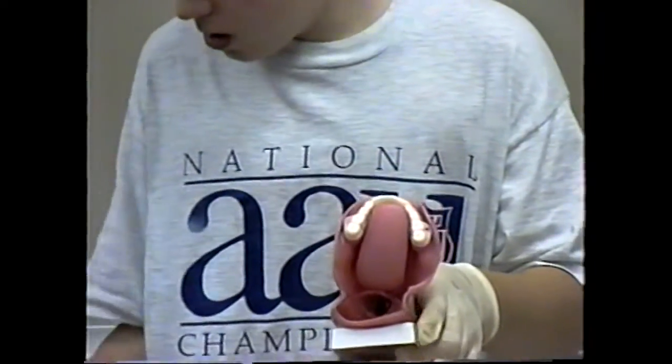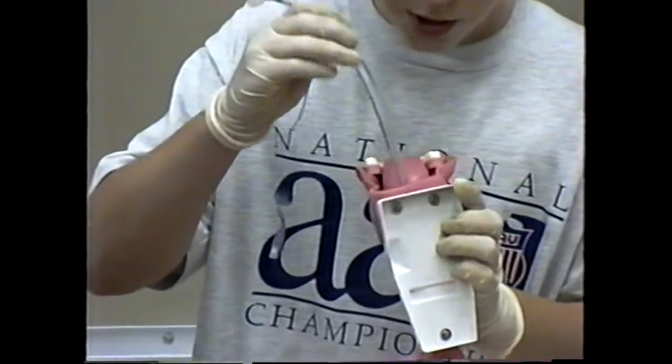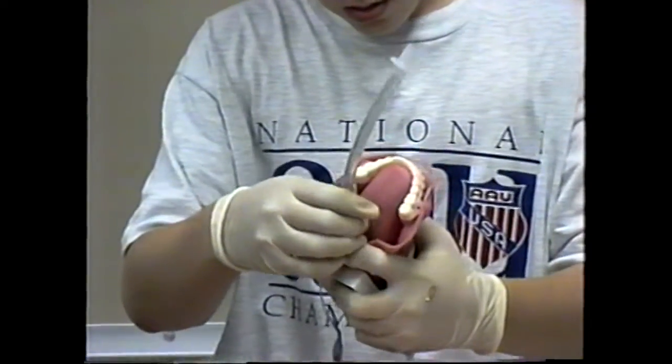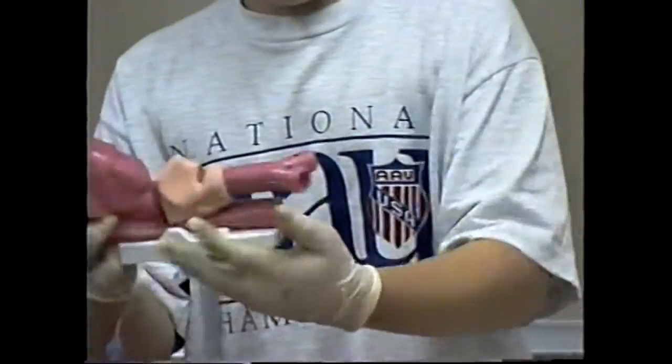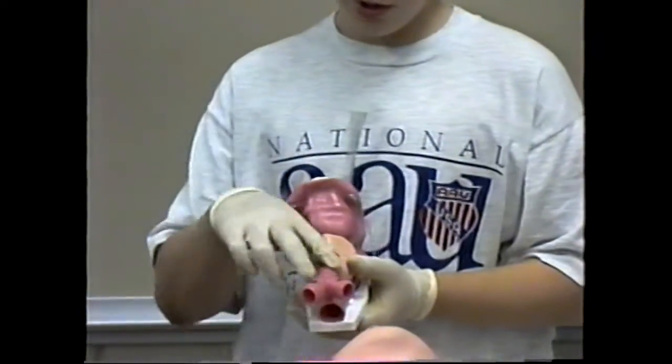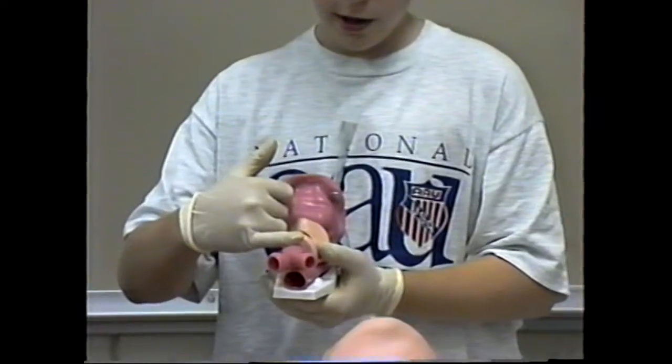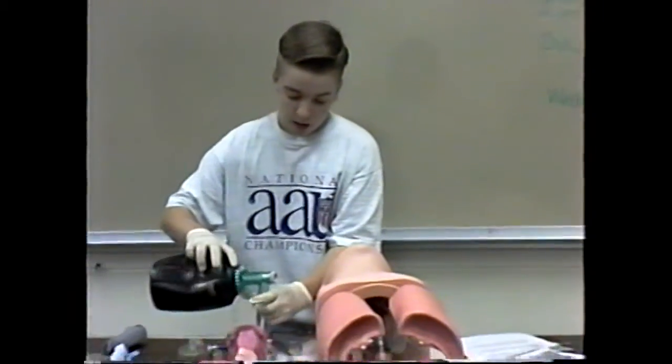And then the tube goes down your trachea. The trachea splits off into one lung and the other lung, and the tube stops about right here. And then when you ventilate, it puts air into the lungs.